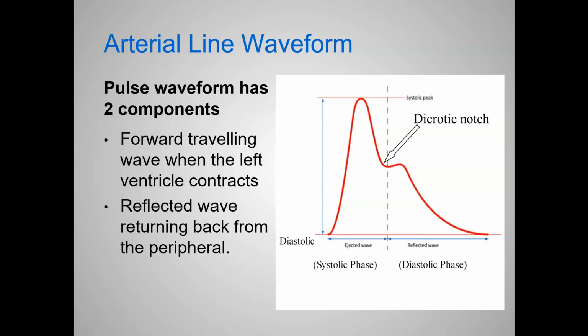If your pressure bag's not inflated, it will dampen the reverse pressures, and therefore it starts decreasing your waveform values. So if you see a tombstone or half-dome looking thing, chances are either your bag's deflating, your arterial line may be pressed up against the arterial wall, or it may have a clot beginning to form on the end of it, obstructing blood flow and sensing from the arterial line. So that's where we start flushing.